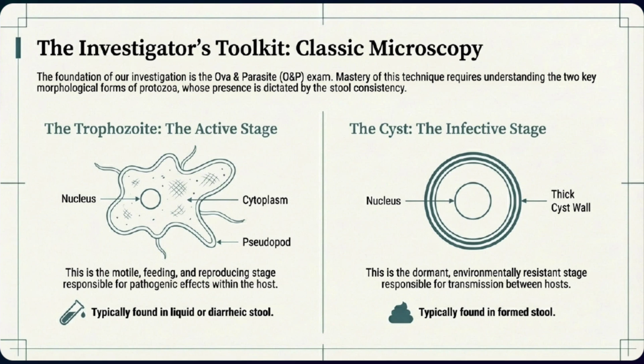So know what you're looking for, and it can be quite tricky to find them because with amoebas, especially when you put them on the microscope, first of all, it has to be a very fresh sample, and also when you put them on the microscope, they often stop moving, and so it can be quite tricky to actually find them.